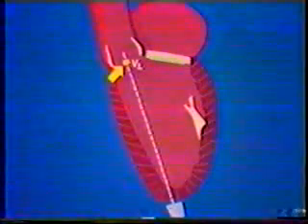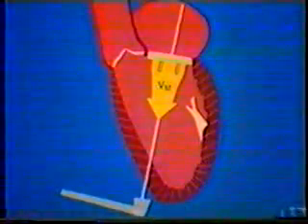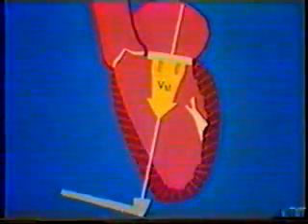The diameter of the left ventricular outflow tract is measured from a systolic freeze frame and converted to LVOT area as we previously discussed. From apical long axis, the velocity spectrum from the LVOT is recorded by placing a PW sample volume just below the aortic valve. Using the continuous wave mode, we record the velocity spectrum from flow across the mitral prosthesis.